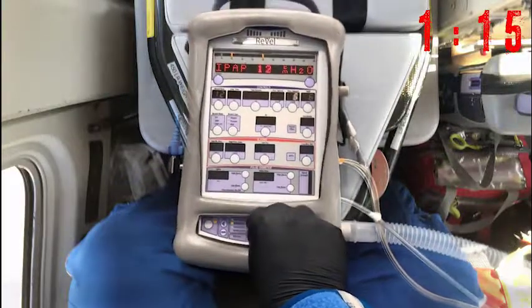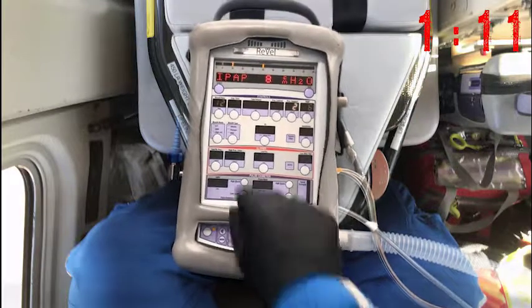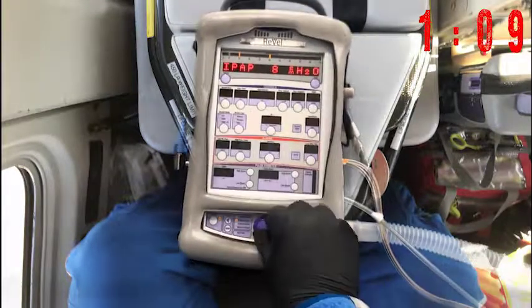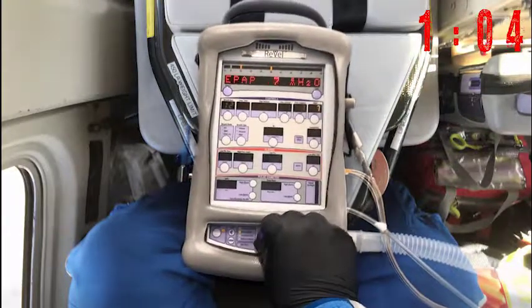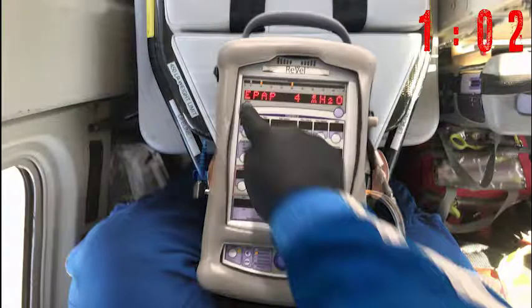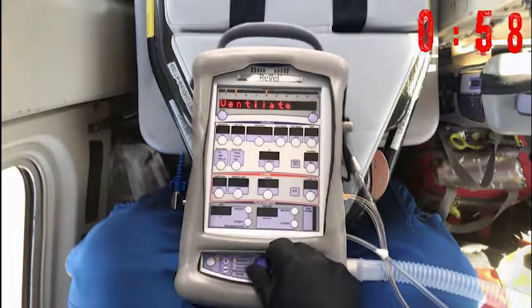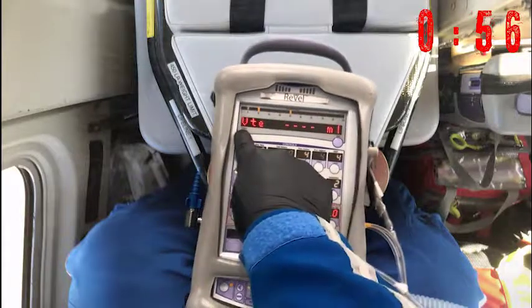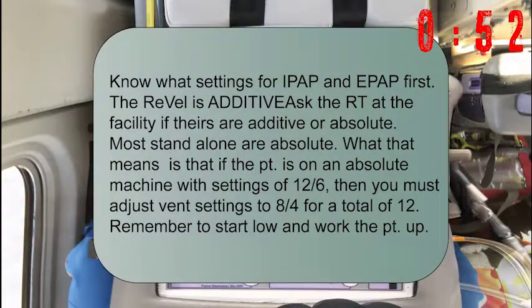Next you're going to set your EPAP and your IPAP settings. Make sure you get those from the hospital, or start low and work up based on your program's protocols. Ensure that your backup rate is set to 12 and hit Ventilate. Then go into Vent Config and make some minor adjustments to make it easier for the patient.